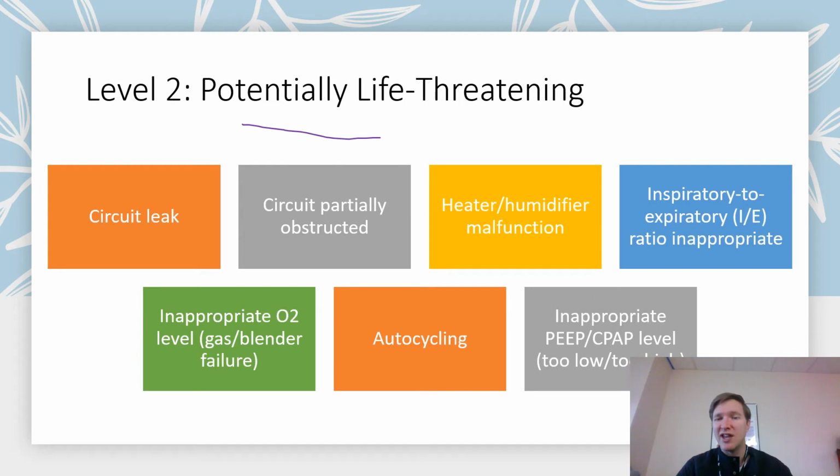Because that could be potentially life-threatening, especially on patients that have air trapping processes, that have longer or slower lung units that we need to exhale longer, like your COPD patient population. Are you sure you want that IE to be even, that 1-to-1 ratio, when we know that that person could have air trapping, they could have potential harm from there? So that's why it's potentially life-threatening, for sure, on that COPD patient population would be the primary application. There are others as well, but that's the primary.